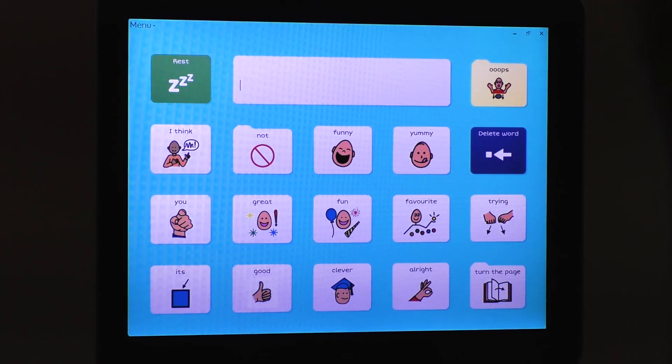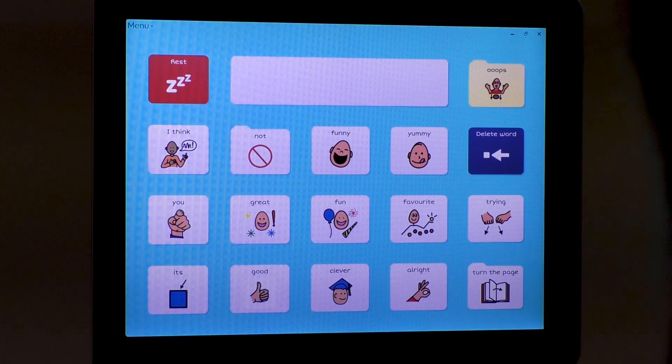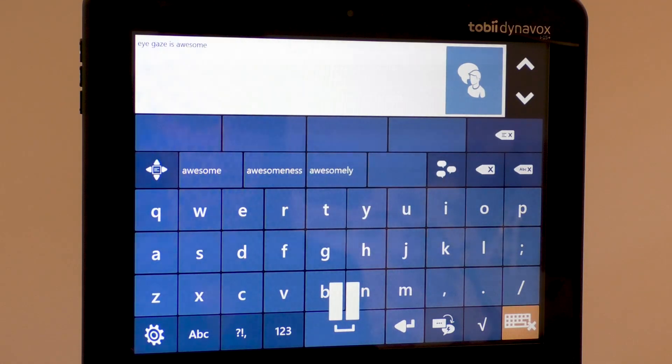Different systems and software have options for a student to rest or pause their gaze. This can be helpful when needing more time to look around an unfamiliar screen before making selections, or when needing to take a break and not wanting to make accidental selections. Each system has its own options and settings. You can refer to the system manual or contact the suppliers to find out more.